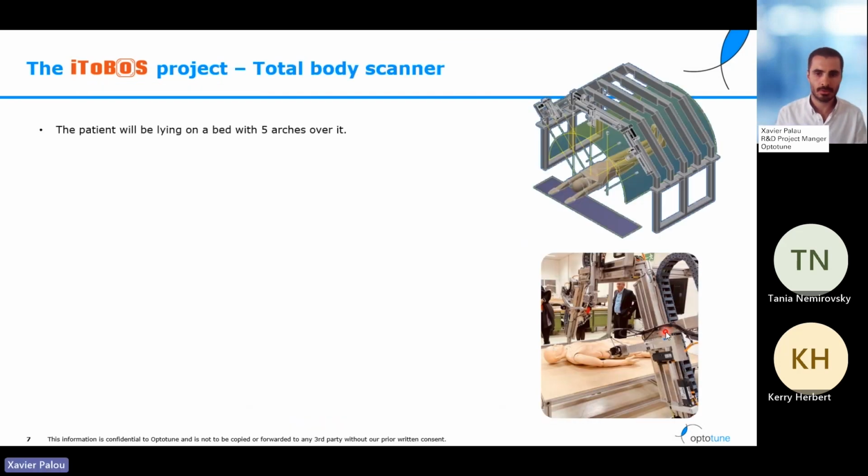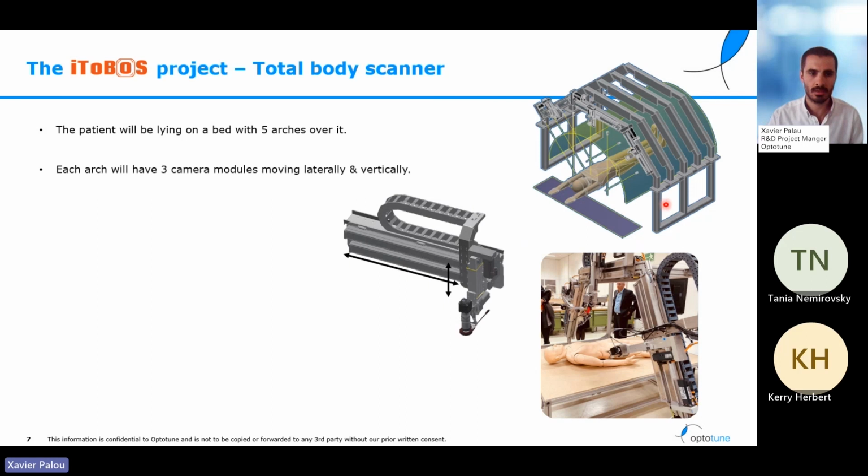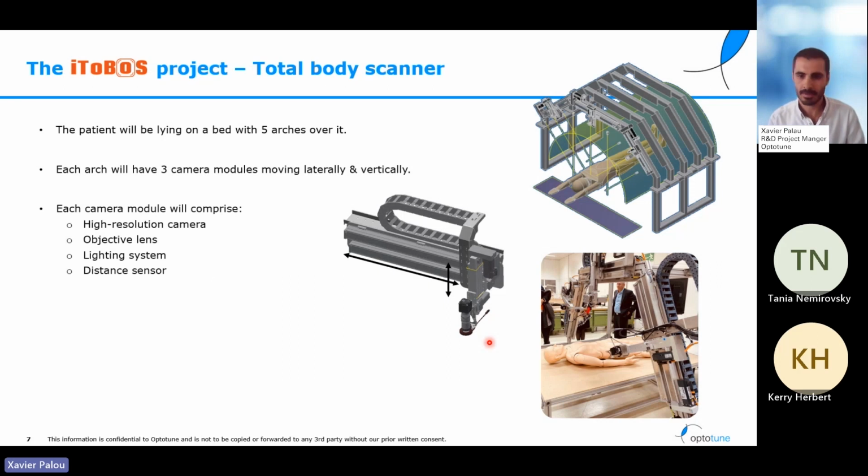As you can imagine, Optotune as a hardware company will be working on the creation of this new body scanner. The body scanner will be based around a bed where the patient will be lying, and around the patient there will be 5 arches. Each one of these arches will feature 3 camera modules that will be able to move laterally and vertically such that they can cover the whole surface of the patient's body. And finally, each one of these modules will have a high resolution camera because we want to be able to have images that give enough detail to the doctors to see all the features of the mole.